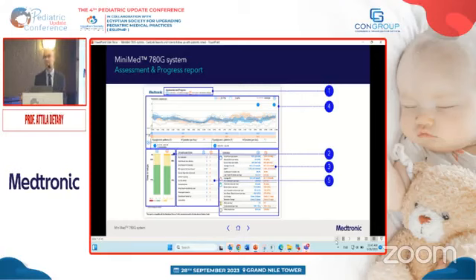This then tells the algorithm to choose these two and color them. So the blue color is the recent 2 weeks, and the brown color here is the reference period. So in this example, as you see, the control is very good.